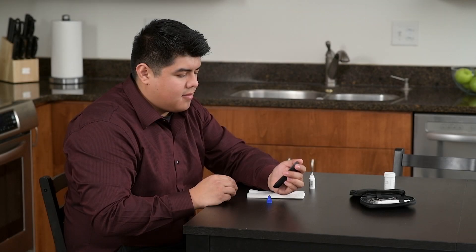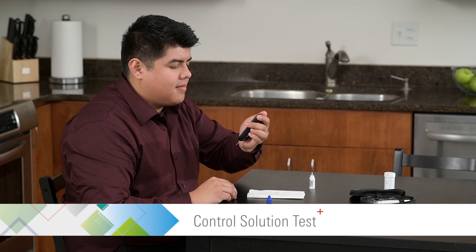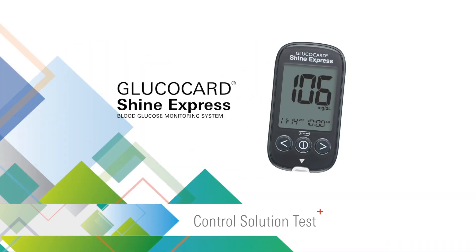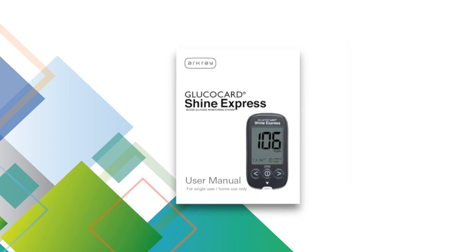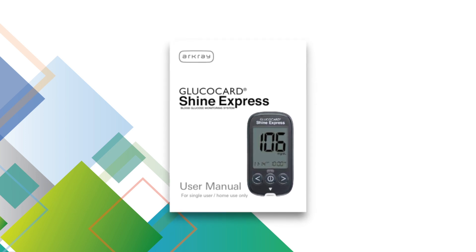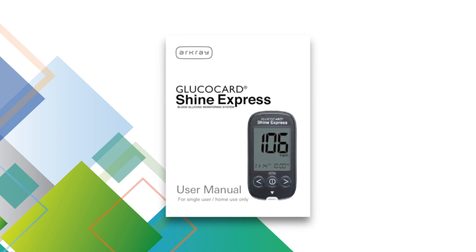This video provides an overview on how to perform a control solution test with the Glucocard Shine Express Blood Glucose Monitoring System. For complete instructions and when to perform a control solution test, please see the user manual supplied with the meter.